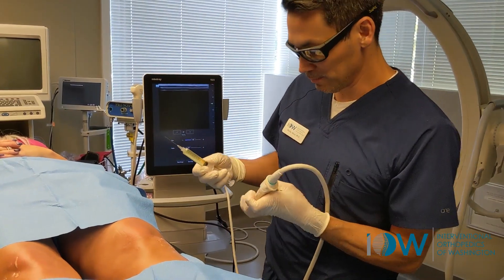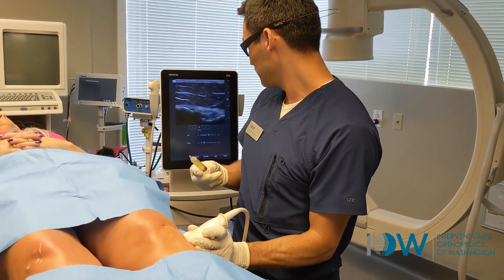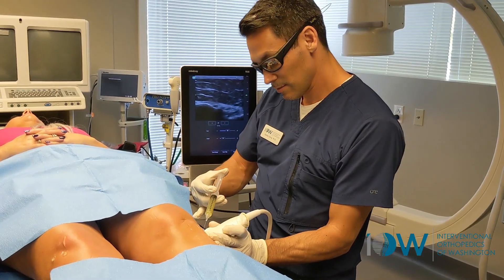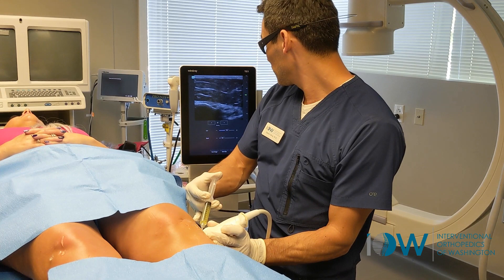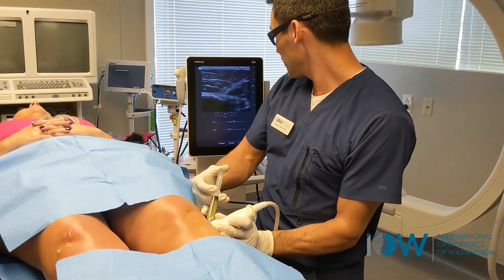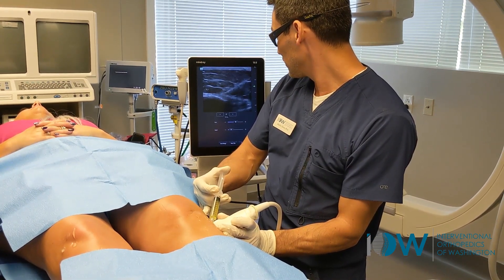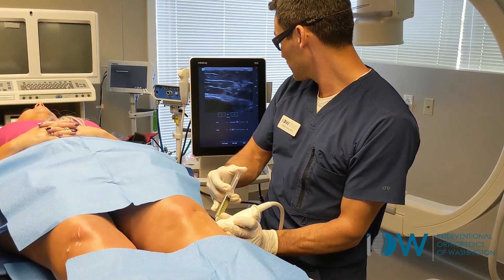We're going to treat it with some prolotherapy. Prolotherapy is great in helping to strengthen those ligaments. We poke here. You see the needle going right directly into the attachment point of that LCL on the fibular head. And I'm going to inject it at multiple points.